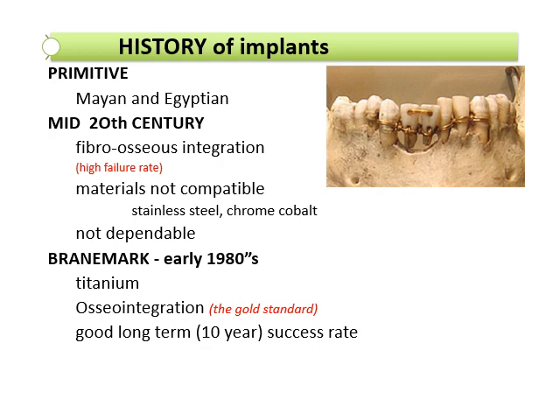So Dr. Brånemark, in the early 1980s, discovered that titanium was a biocompatible element that the body didn't recognize, and therefore didn't try to push out. I do have a really good short video under week 13 as well, where a doctor explains the purpose of osseointegration and titanium.